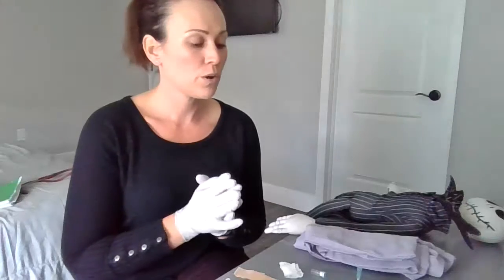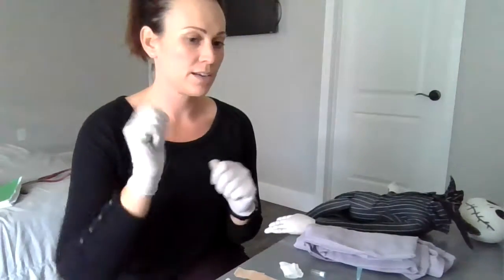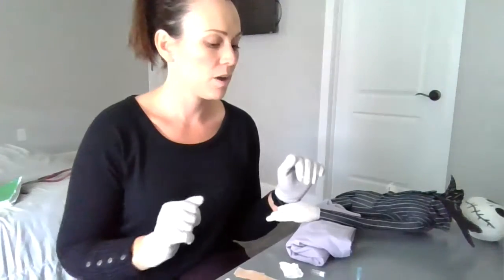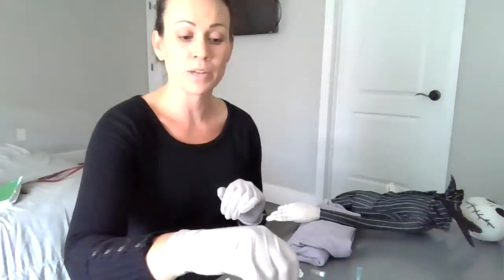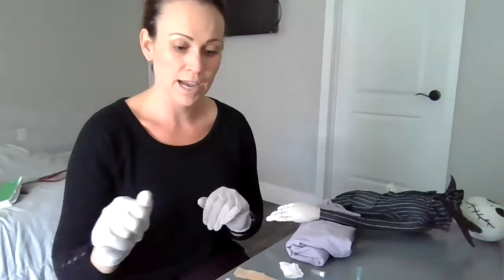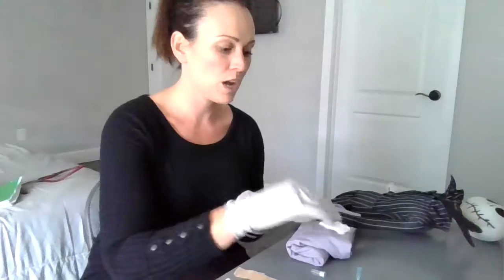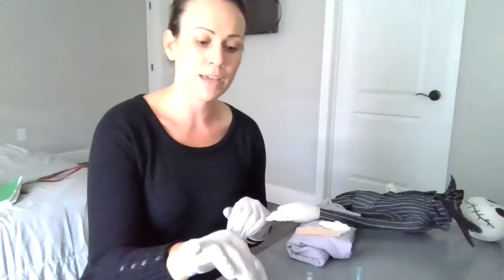blood draw. So I have my ABG kit. I'm going to open it up. I'm going to get a towel here and place the patient's wrist on the towel. I'm going to fill out the patient label, put the name, I'm going to take the patient's temperature, room number, date, and time that I took the test. I'm going to place it on my bag already, so I'm ready to go. I have some gauze on my towel. I'm going to put the Band-Aid already prepped and ready, and the cap and everything.